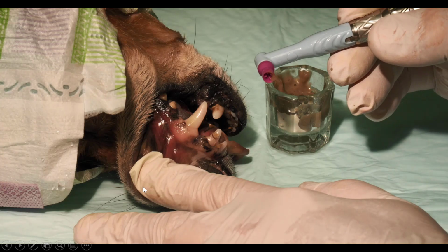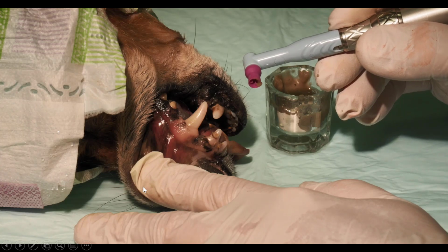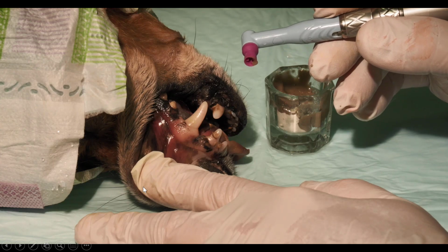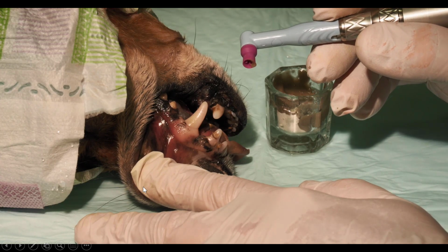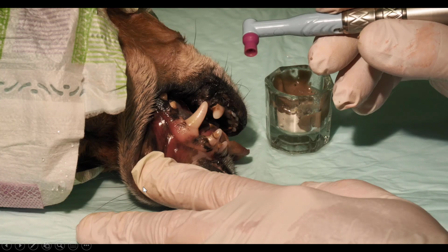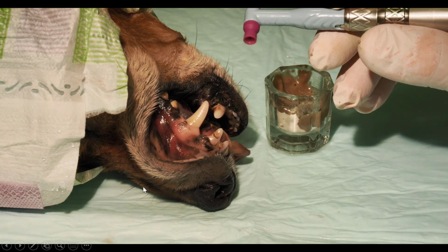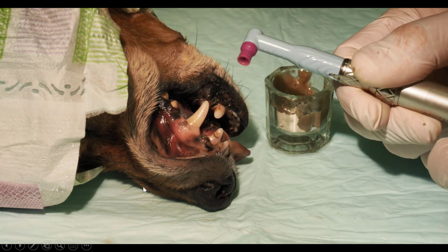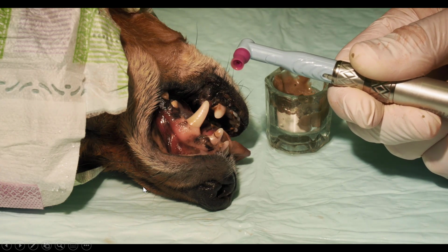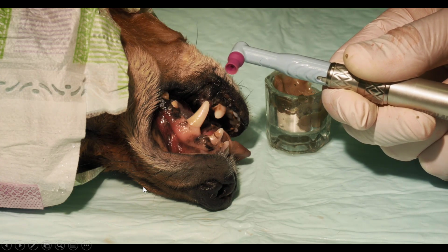and we use disposable ones so it's nice and sterile for each patient. One of the keys when you're doing polishing is not to have this going too fast. What happens so often when I go into practices is this thing's going 1,000,000 miles an hour, and that's going to overheat the tooth. So what it should sound like is something about like this. That's a nice speed. If it doesn't sound like that, there is a little black dial right here that's your speed control. And you can turn it, hear how it's getting slower and faster. You want to have it about right there, just above stall speed, and that will polish the tooth without overheating it.